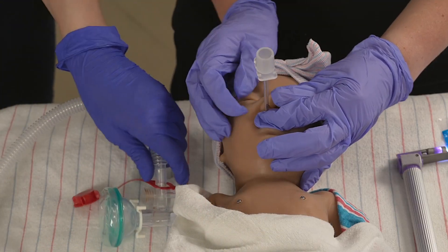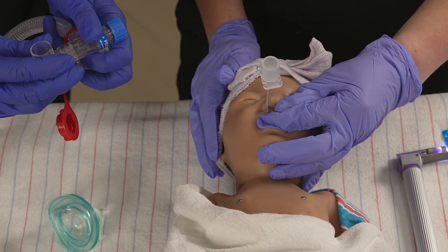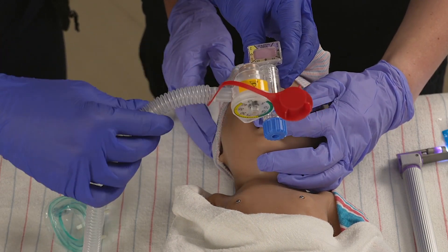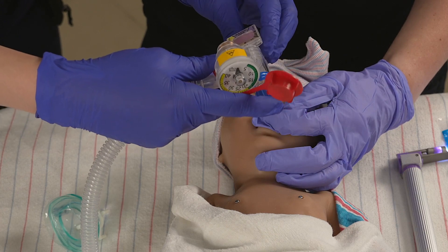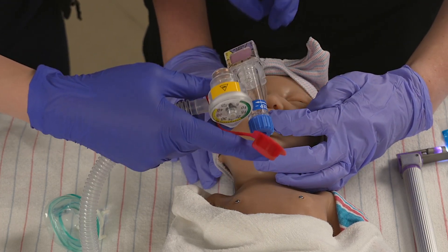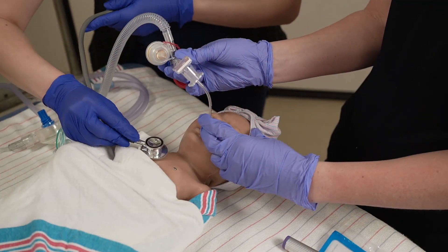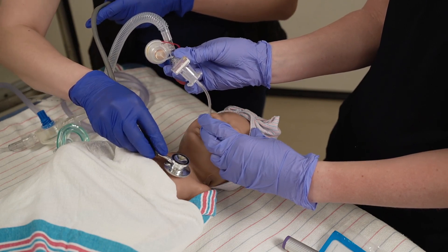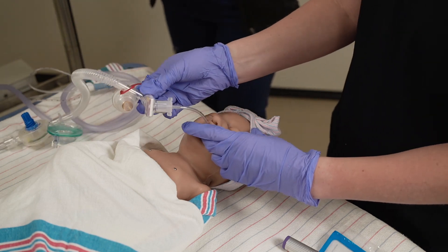A carbon dioxide detector, or CO2 detector, will be attached to confirm the presence of CO2 and should turn yellow. Vapor condensation in the ET tube also shows the ET tube is in the trachea. Attach a T-piece resuscitator or a resuscitation bag and provide manual breaths. Another provider will auscultate for bilateral breath sounds. Look for bilateral chest rise, an increase in heart rate, and oxygen saturation.